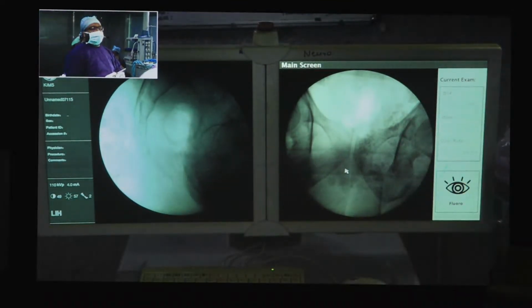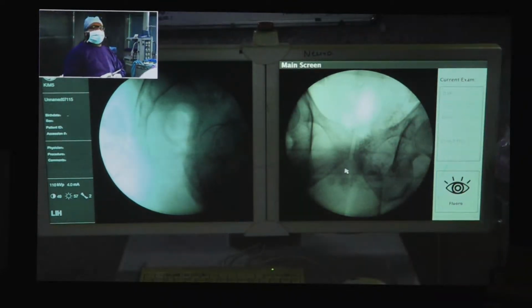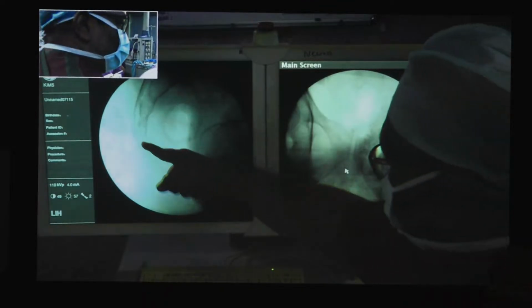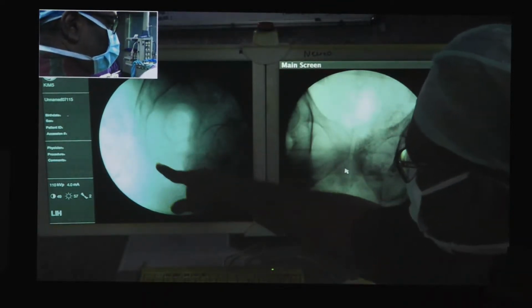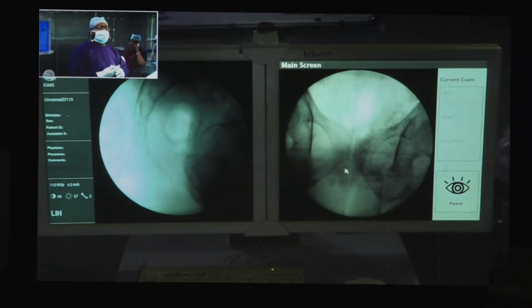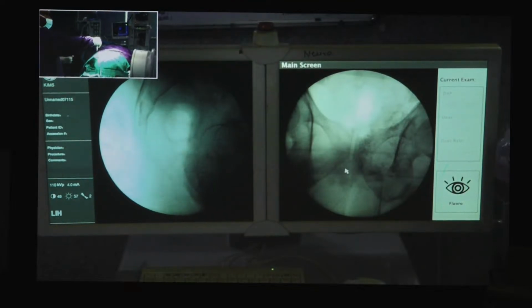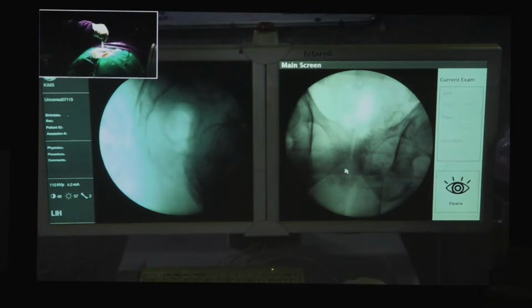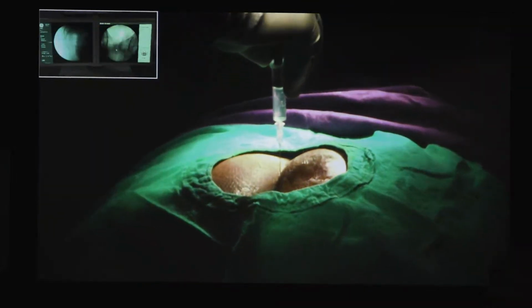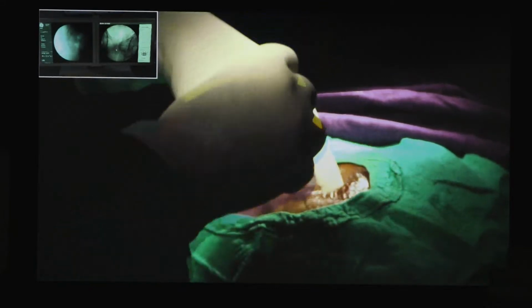We would like to enter at the sacrococcygeal ligament somewhere there and be just anterior to the coccyx, because the ganglion impar is the terminal coalescence of the sympathetic chain. So we would like to do a diagnostic block to see whether the patient has relief. So I'll first infiltrate the skin in the anal region. Okay, so I'm infiltrating in the midline.